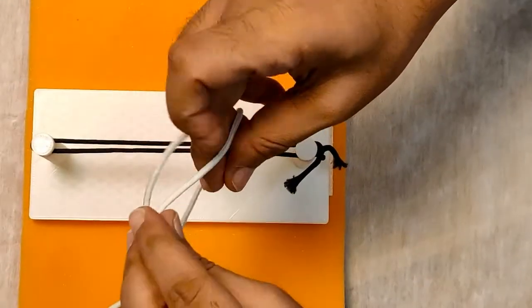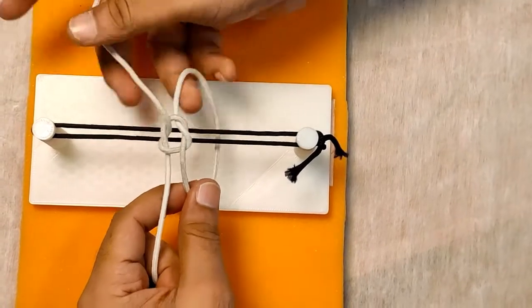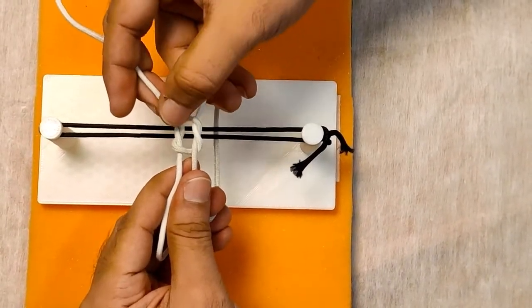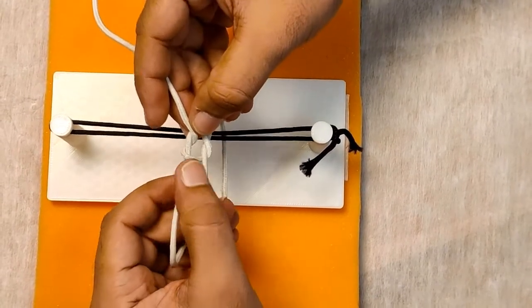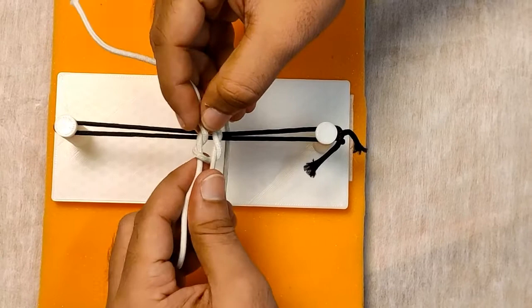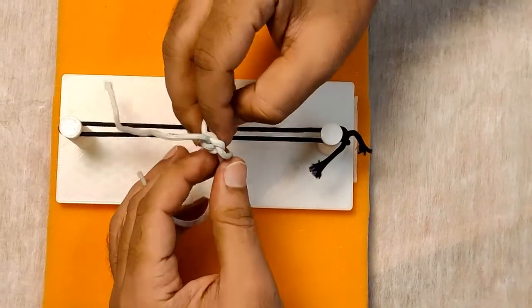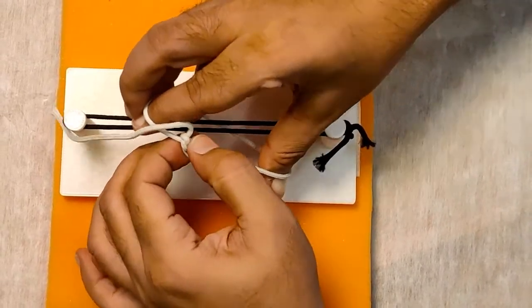look like this. You have a thread going above the loop and a thread going below the loop. Similarly, over here, a thread going above the loop and a thread going below the loop. When we tighten this up, it should look like this, but this knot has a tendency to slip.